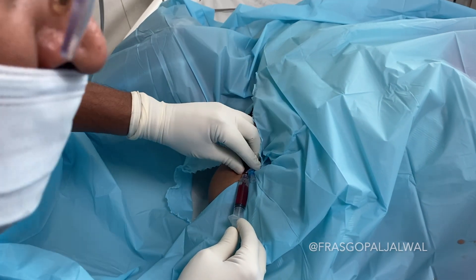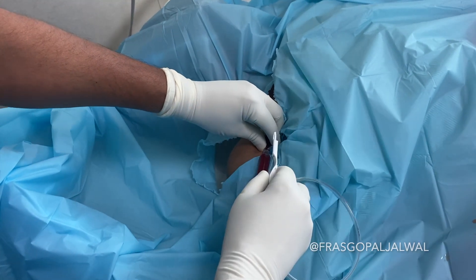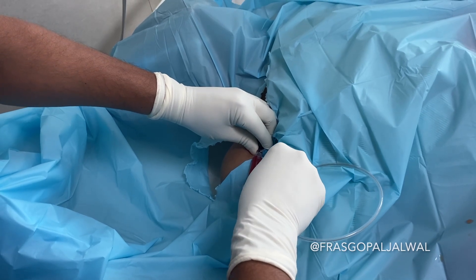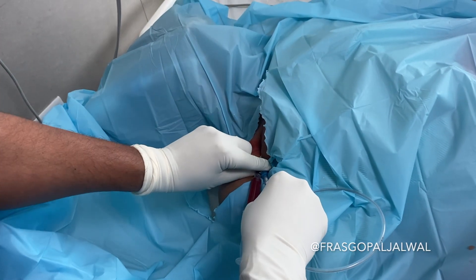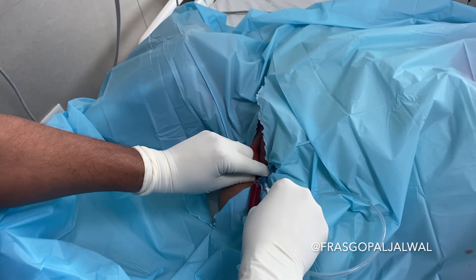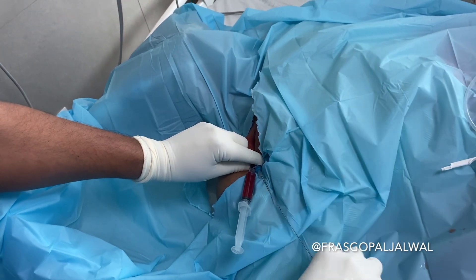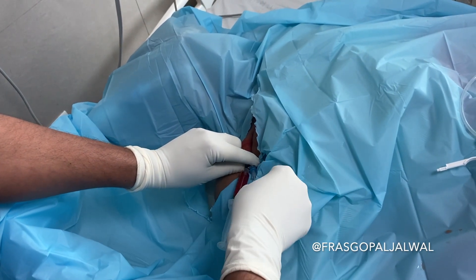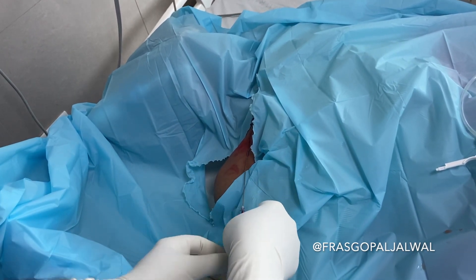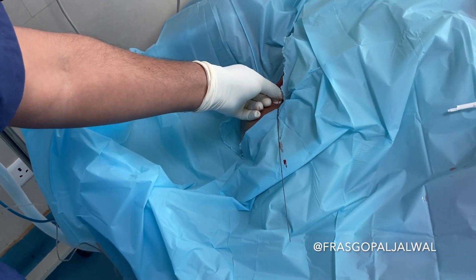You can now see that the subclavian vein has been punctured. I am going to insert the guide wire slowly. You must watch the ECG during guide wire insertion, because if arrhythmias appear on the ECG, you must withdraw the guide wire.